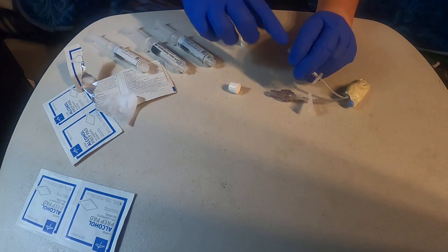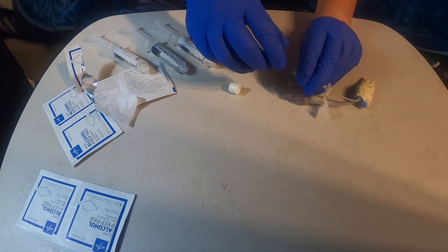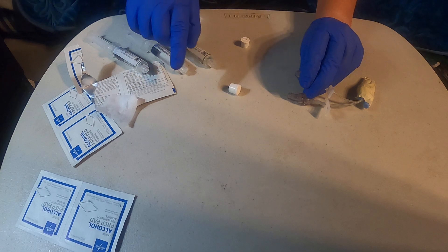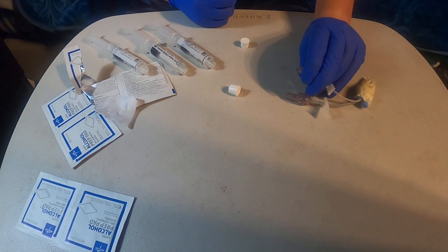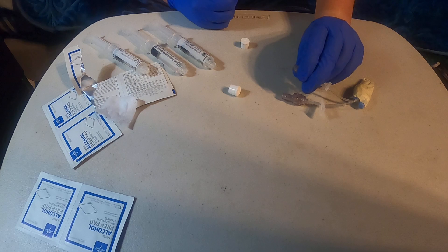Now, there are different ways to do this. Certain hospitals have vacutainers that attach to the bottom of this, and you have your tubes — you just puncture it in and the negative pressure in the tube pulls all the blood out by itself. Certain hospitals will require you to just pull it with the syringe because they feel the syringe will not damage the vein or the PICC line.